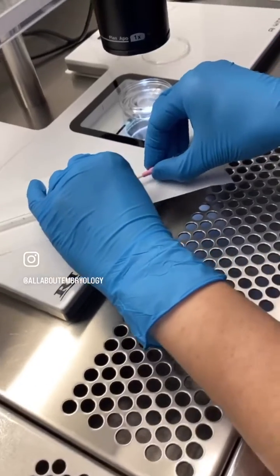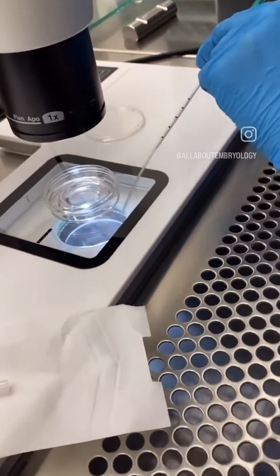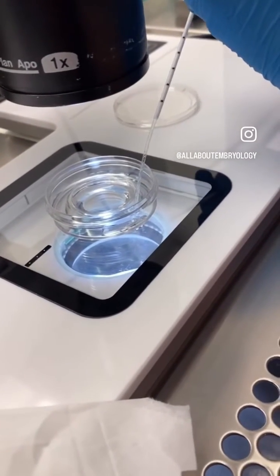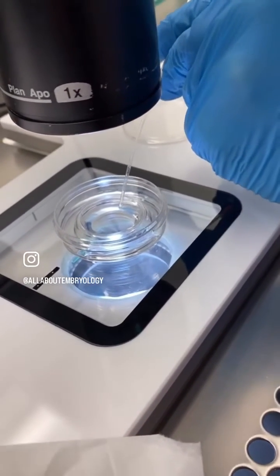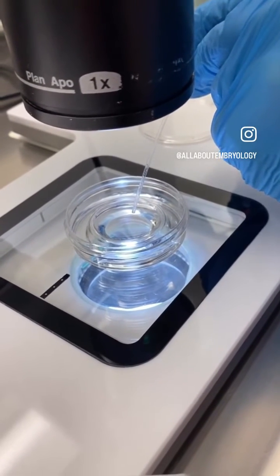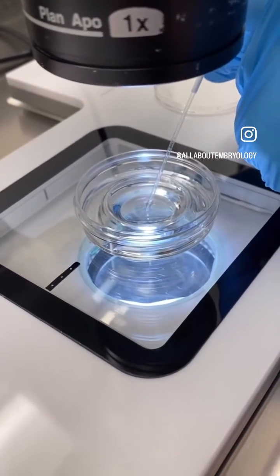The embryologist is now ready to load up the catheter. First they need to flush the catheter through with the solution. Then the embryologist will load the catheter with one column of air first of all, then the embryo, and then one further column of air.